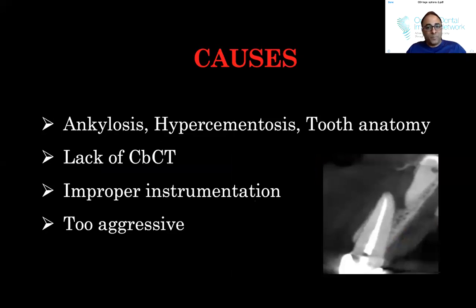Of course, anatomy, ankylosis, hypercementosis, these things make teeth harder to remove. Look at anatomy. Look at this picture here. This is a case that I showed some of you on the YouTube Dentistry Disrupted page. There is a two-hour webinar that I did on immediate implants, for Hisham and the Dentistry Academy, which I'll encourage you to visit. But in this case, I did an immediate implant. Now, how do you do that? Well, you'd have to watch that seminar.